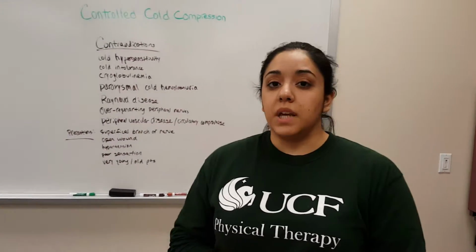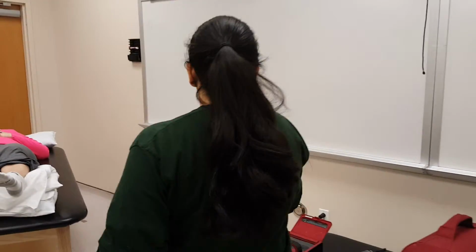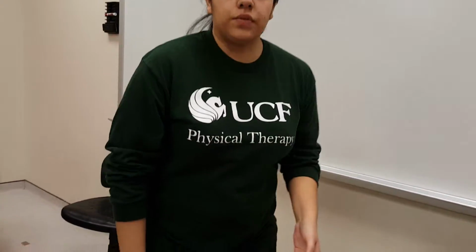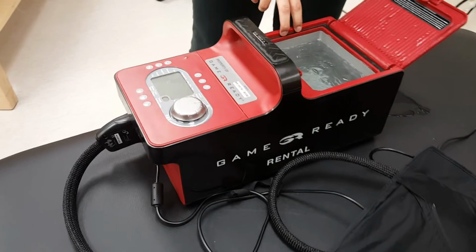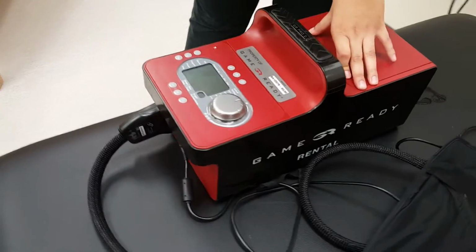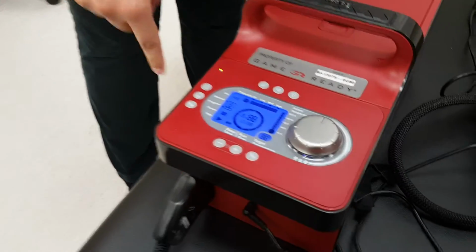So next I will show you the Game Ready. This is a modality used for controlled cold compression. First you would fill this container with ice and water, and then you would close it. And then you would turn it on, as so.